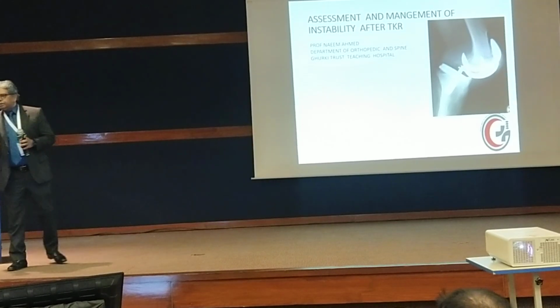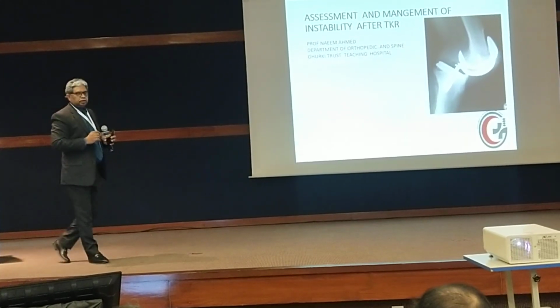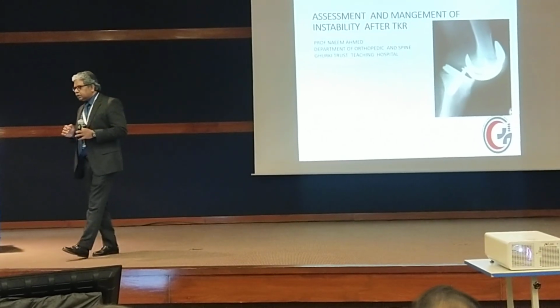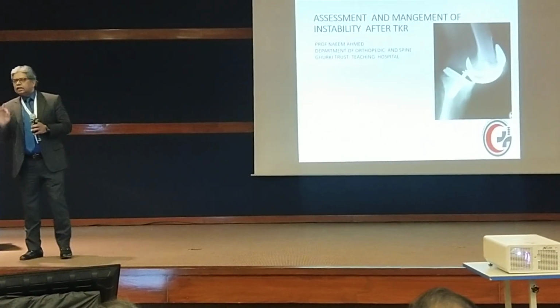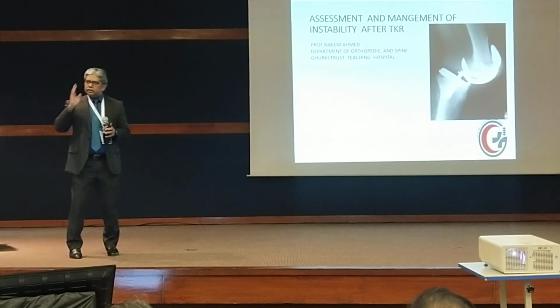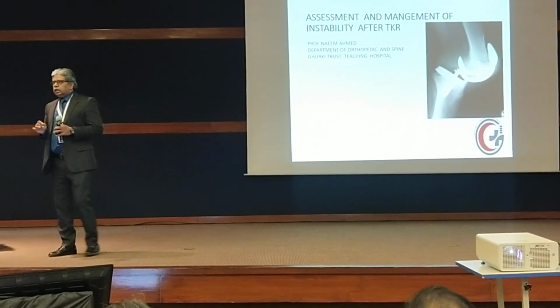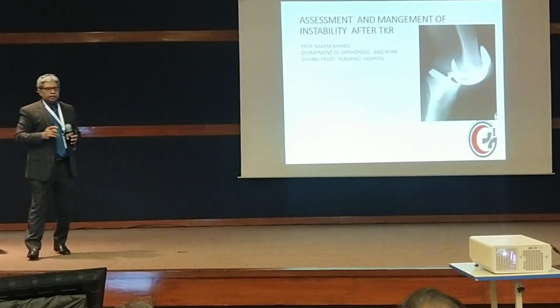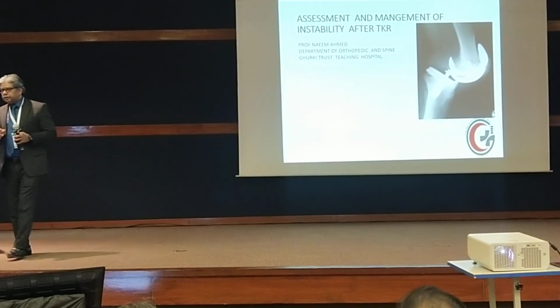This is the most important part of the primary total knee faults. हम बड़ा अच्छा टिबियल कंपोनेंट डाल देते हैं, फेमोरल कंपोनेंट भी अच्छा डाल देते हैं या डालने की कोशिश करते हैं, लेकिन पैटेलोफेमोरल को हम ध्यान देते नहीं. Now there are so many problems with the unhappy knee because of patellofemoral maltracking.